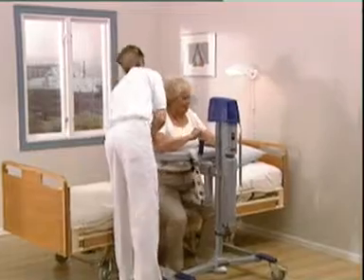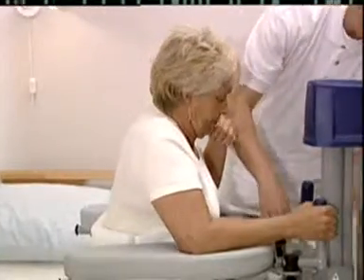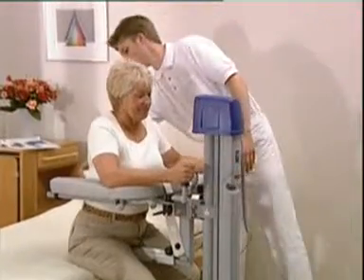From the moment it is wheeled to the patient's bedside or chair, the walker helps to minimise risk. After the sling has been attached behind the patient's back, she can be raised while leaning on the height-adjustable support table.